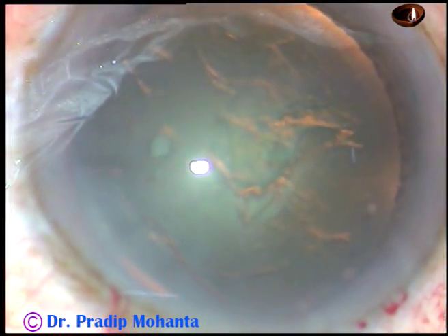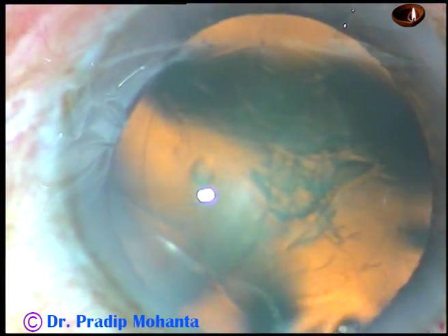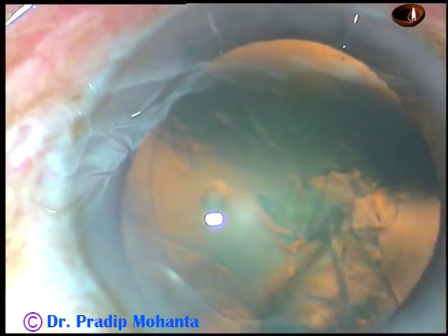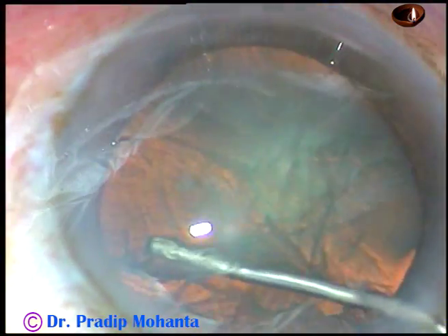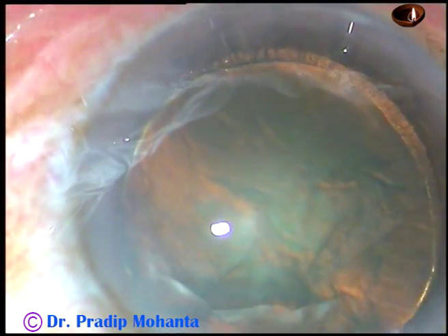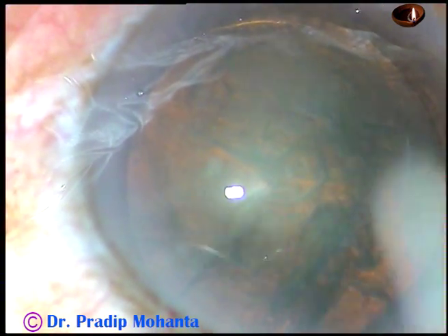And now hydrodissection. Fluid wave is passed just under the anterior capsular rim, and we can see that the fluid wave went to the other side. Hydrodelineation is also done — in this case we can see a faint golden ring.